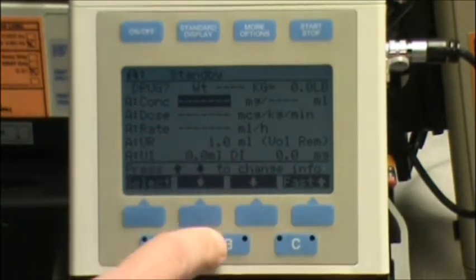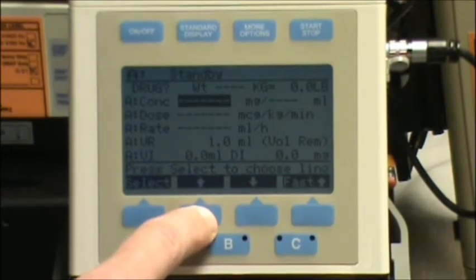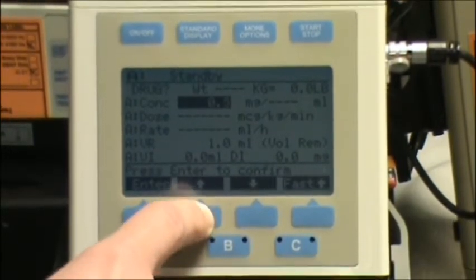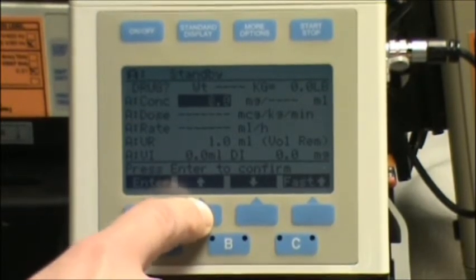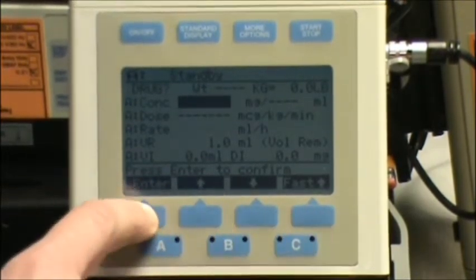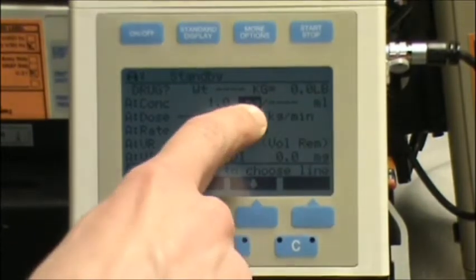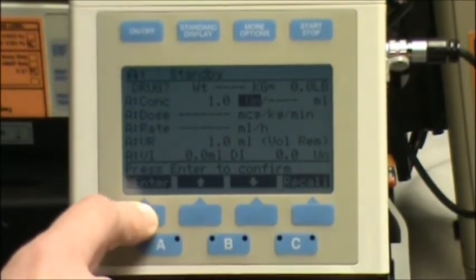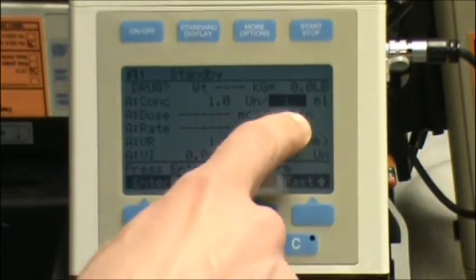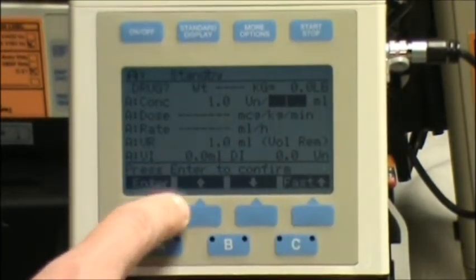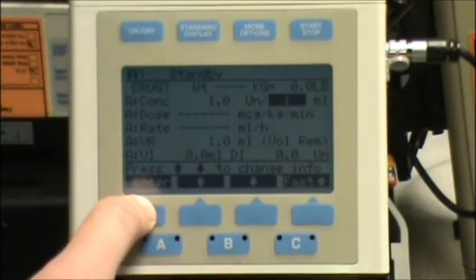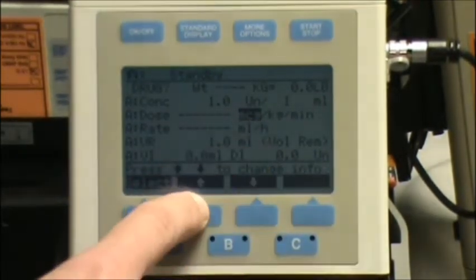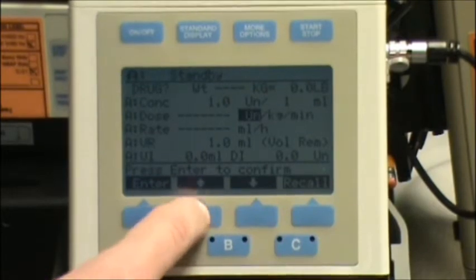So my concentration is 1 unit to 1 ml. So I'll press the up arrow key. Enter. I'm going to change milligrams to units using the up arrow key. 1 unit to 1 ml. I'm going to change this to units. Press enter.